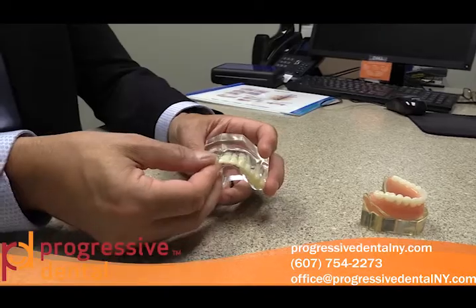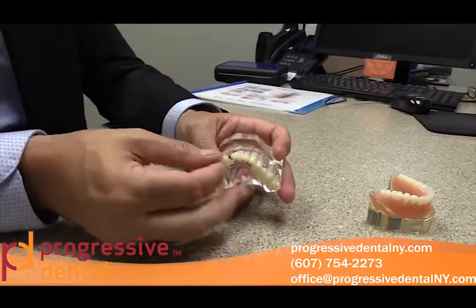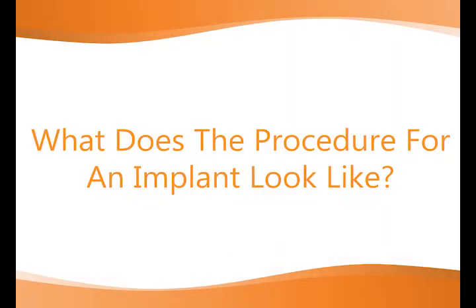The single missing tooth is a very common tooth replacement for implants. The implant is placed where the old root for the old tooth typically was. The bone will determine the angulation of the implant, and once the implant is placed, a cylinder or an abutment is placed inside the implant, which will stick up, and a crown will be made over the top of it.